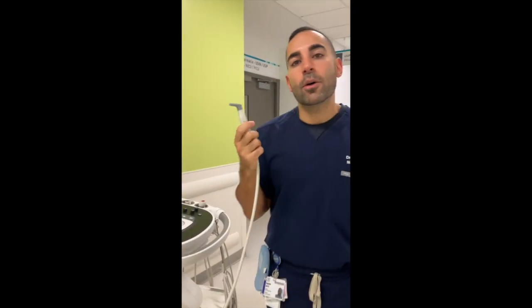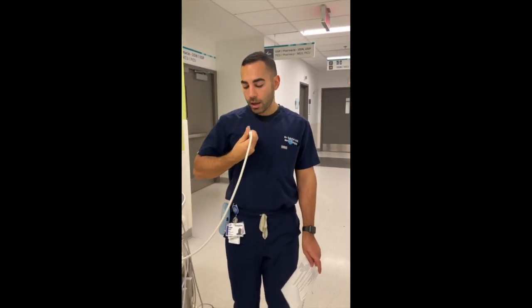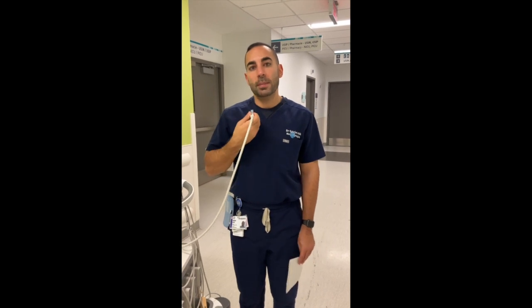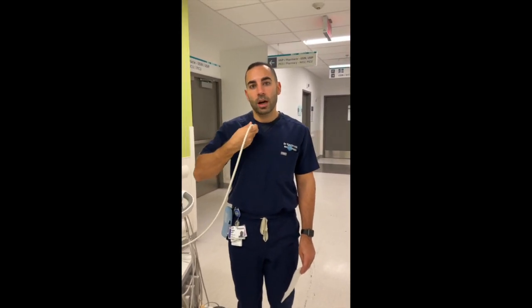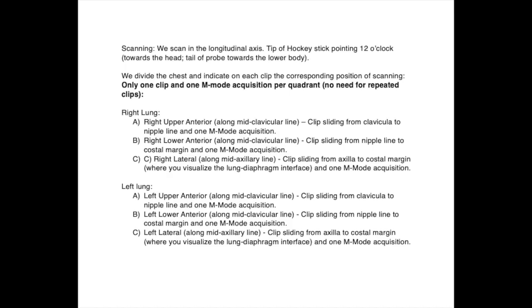Before I showcase on our patient Florence, you want to have the probe pointing towards 12 o'clock — upward. You want to do the three quadrants on each side, so if you're imaging the right chest, you do the upper, then the lower, then the lateral quadrants. Here is the entire protocol: we scan in the longitudinal axis with the tip of the hockey stick pointing to 12 o'clock towards the head. We divide the chest and indicate on each clip the corresponding position of scanning, with only one clip per lung zone and one M-mode per lung zone — no repeated clips needed.